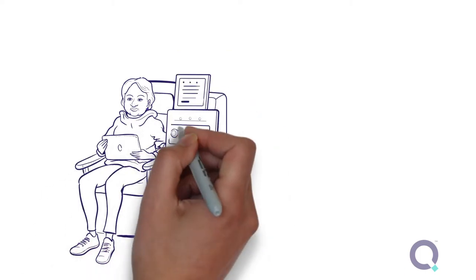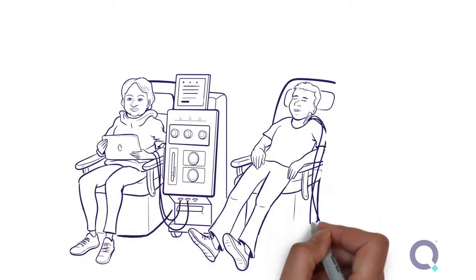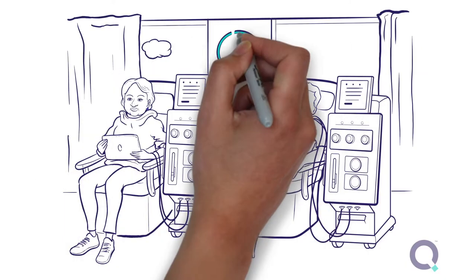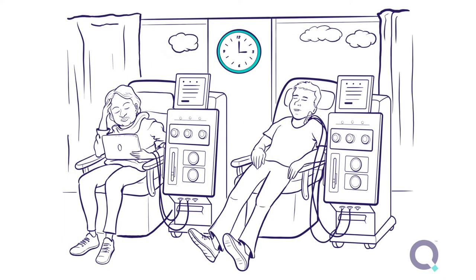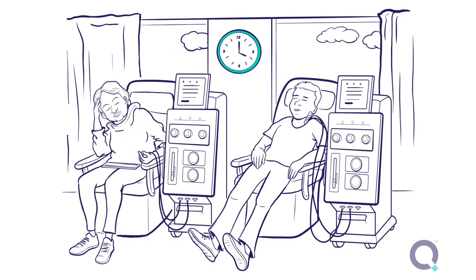In-centre dialysis can be a grueling and relentless regime for patients, dominating and defining their week. Factoring in delays and long journeys to and from the clinic, the four-hour treatment sessions often take up an entire day.